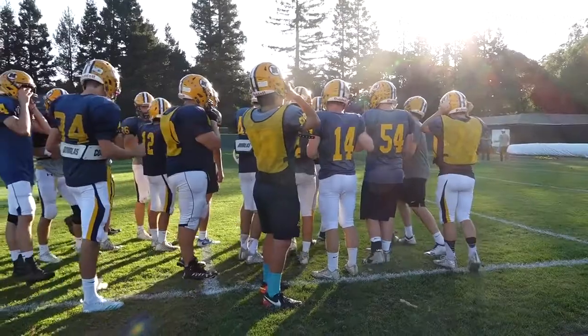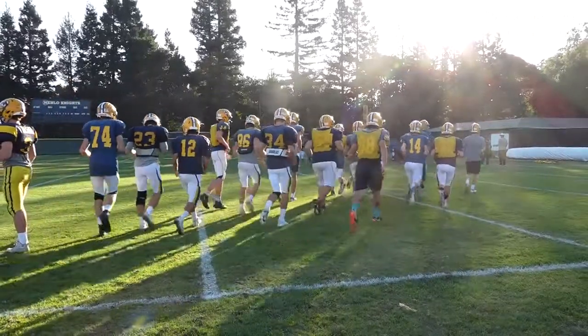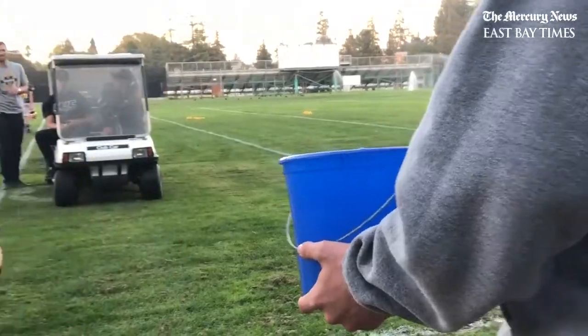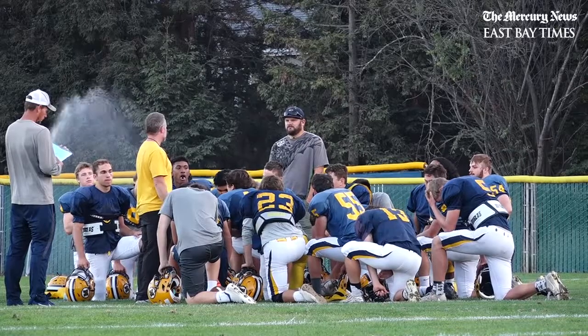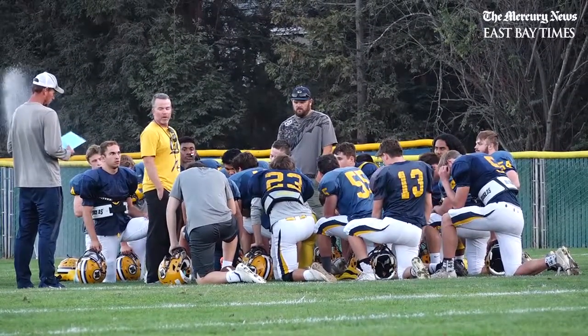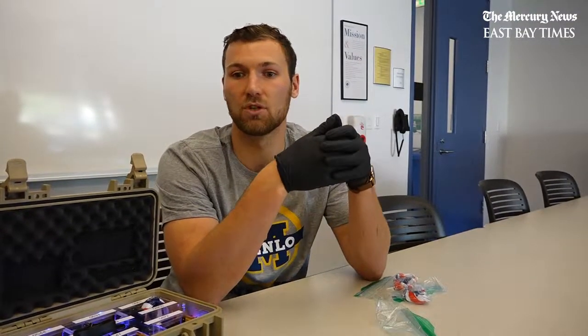At the end of practice or at the end of a game, we look at the data — basically the events that have occurred — by collecting all of the data from these mouthguards via Bluetooth. Because there are no buttons and no way to access the inside of the mouthguard, all data has to be transferred via Bluetooth. Using that data, we can advise coaches and players to change their habits or certain practices to make things safer and give them more information on what they're doing on the field.